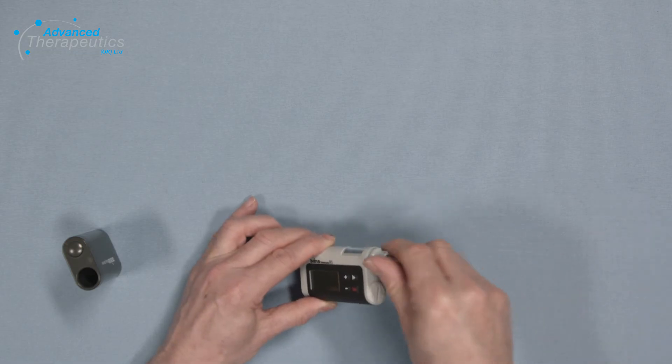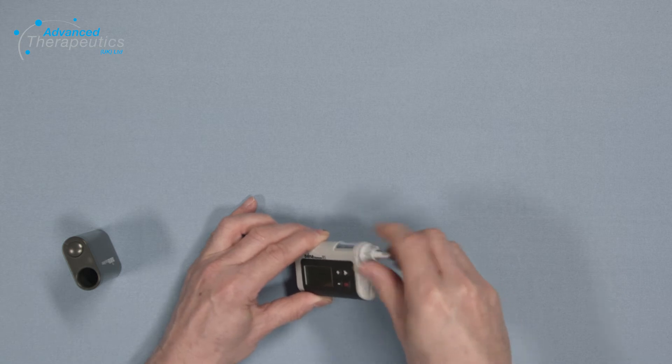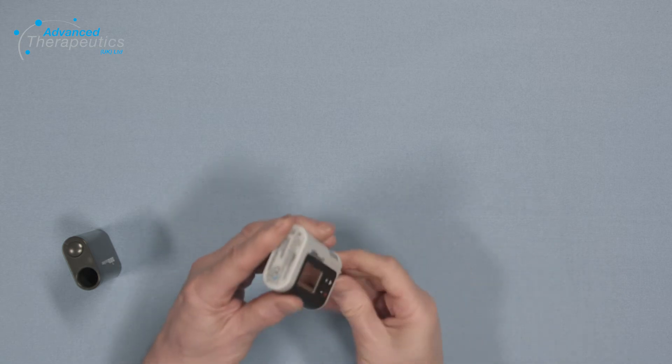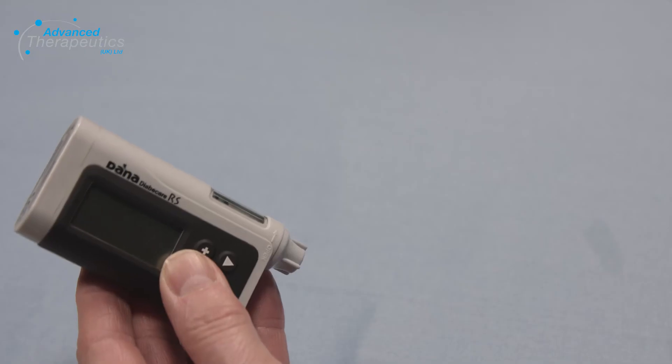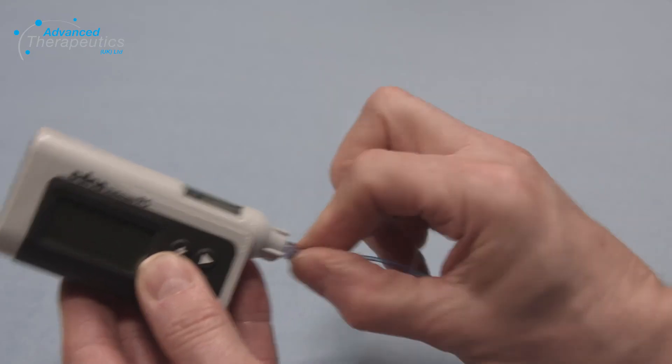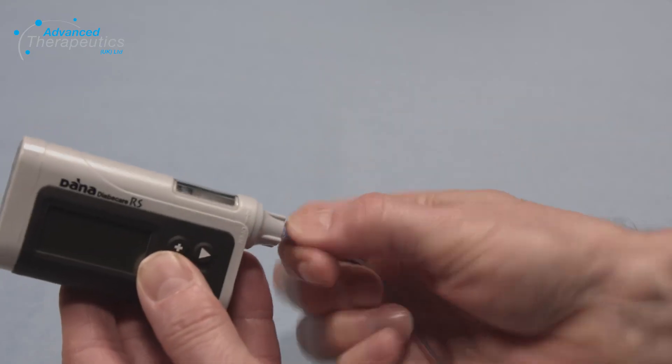Screw on the adapter, remember it's counterclockwise and not too tight. Never use the key to tighten the adapter. Point the pump downwards and then remove the white cap. Attach the new tubing screwing counterclockwise, firm but not tight.